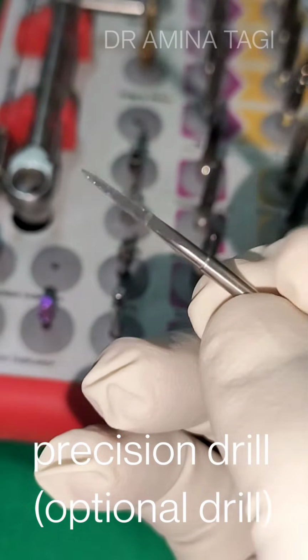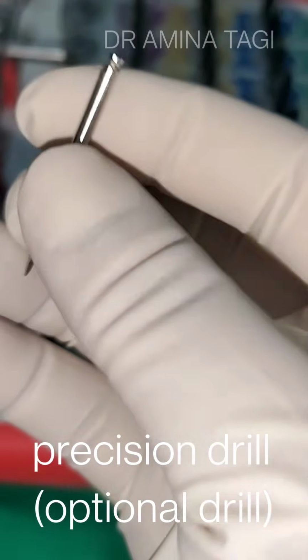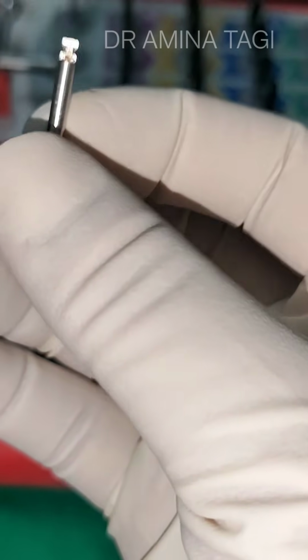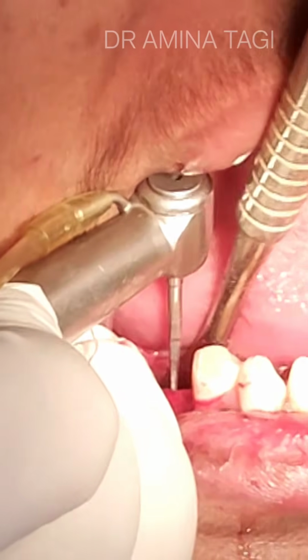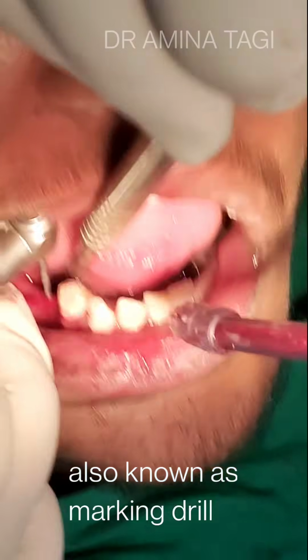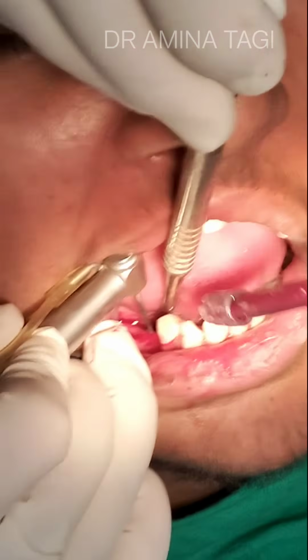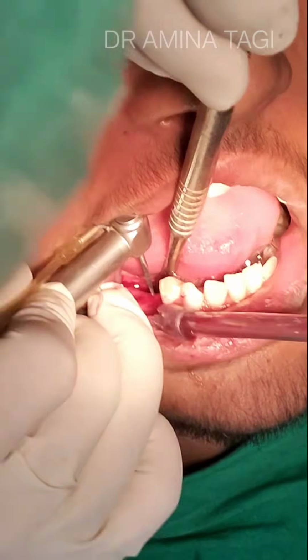So this is the precision drill that we are going to use. This is an optional drill. This is for making a ditch and it is for pinpoint accuracy. It is like marking a place for the pilot drill to be placed, which is the next drill. So if you are placing an implant for the first time, this is very much helpful.